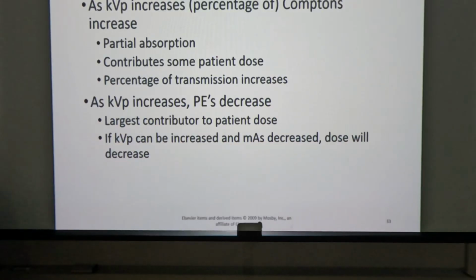So generally speaking, this is just in general, make sure that whenever you read your question, you read it carefully and understand the specifics of it. Generally speaking, when we say as kVp goes up, your answer is going to be, as it relates to scatter radiation, scatter goes up, right? So know that that's not entirely true in context. It's still true, but it's minimally true, right?